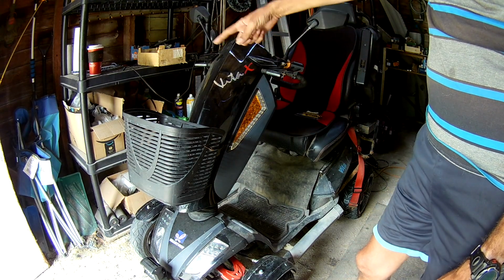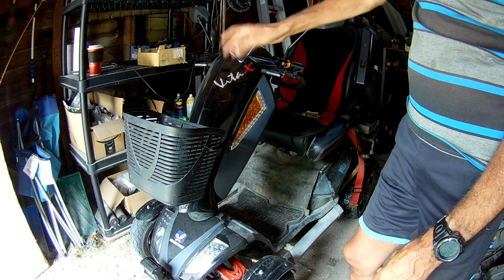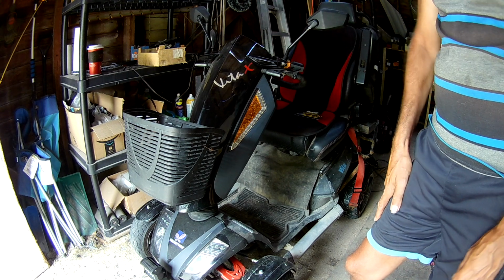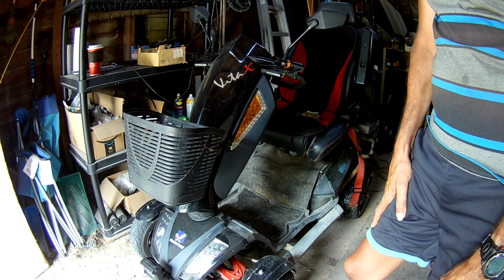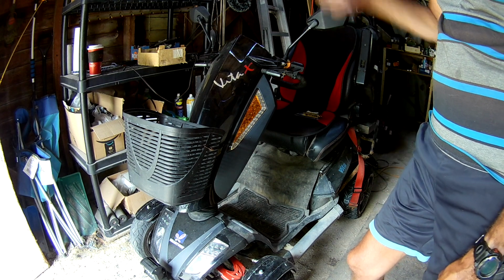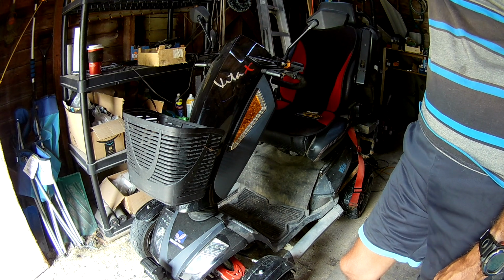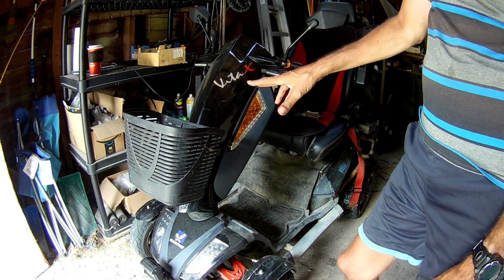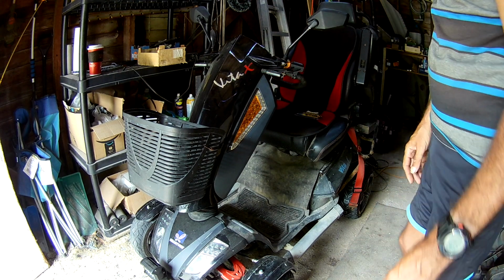So I have a zip tie around the bar, and it's just kind of hooked onto that zip tie, so it's free to move around. It wasn't a problem before, but it's starting to be now. So I'm hoping that's what's rattling, because I can't see anything else up there that's moving around. So it's kind of an annoying rattle. It's time to fix that. So I'm going to open this up and take a look and kind of go from there.